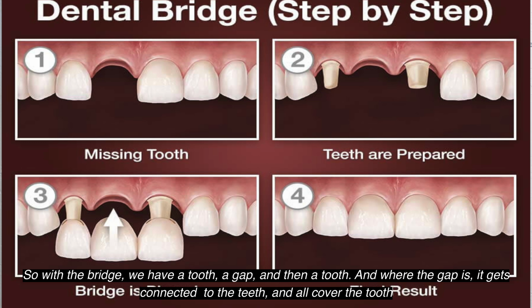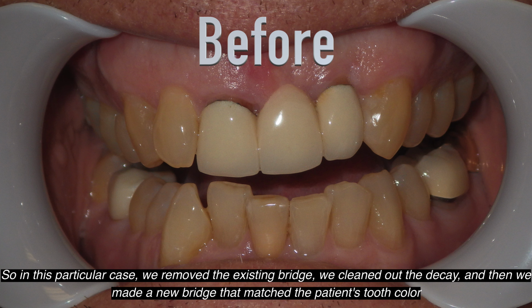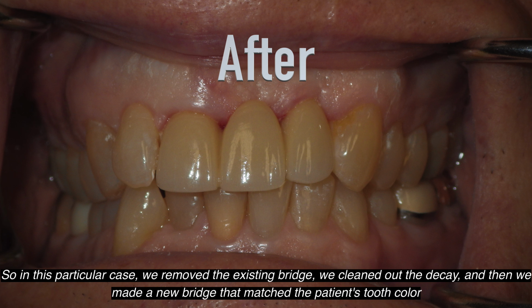So with a bridge we have a tooth, a gap, and then a tooth. And where the gap is, it gets connected to the teeth and it all covers the tooth. So the inner part of the tooth is still preserved and it's all connected. So in this particular case, we removed the existing bridge, we cleaned out the decay, and then we made a new bridge that matched the existing patient tooth color.